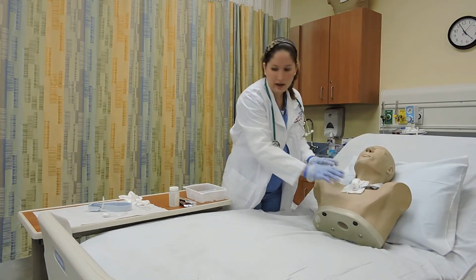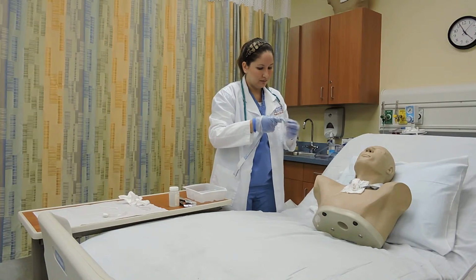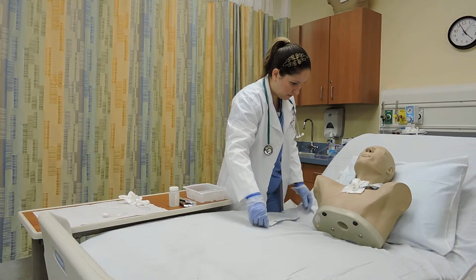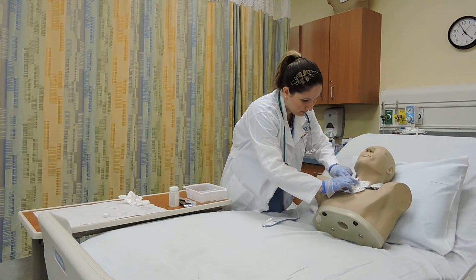Okay, now we're going to change the tracheostomy ties with clean and new ones. We're going to remove one side first, always holding on to the flange.